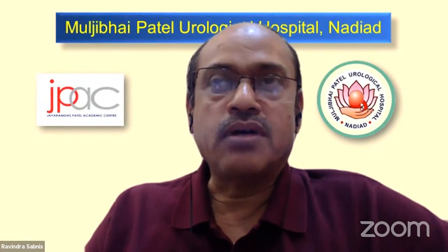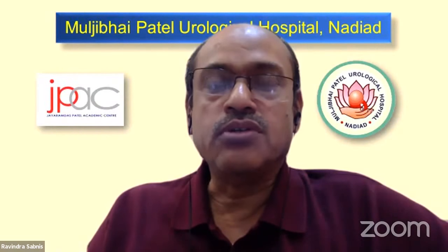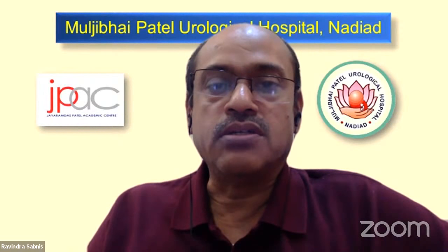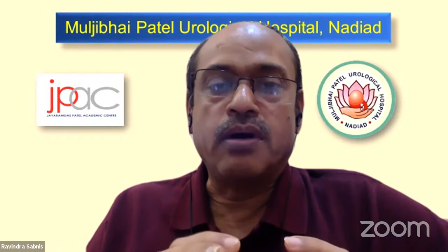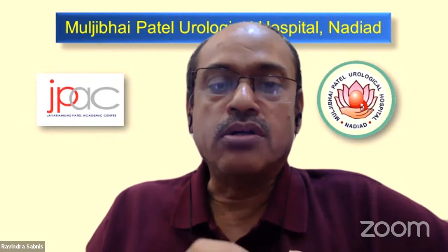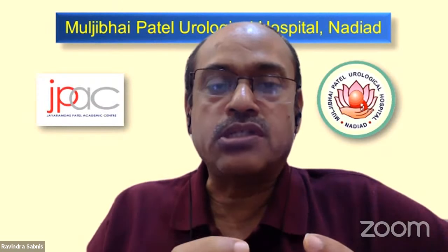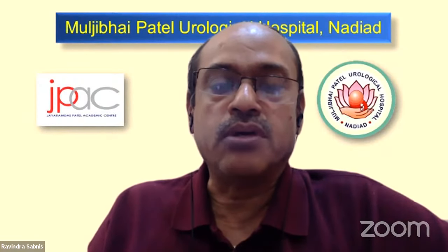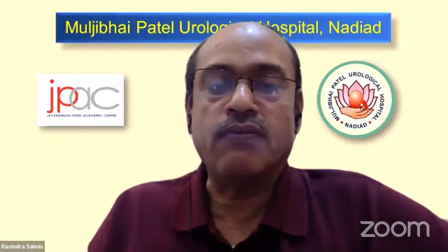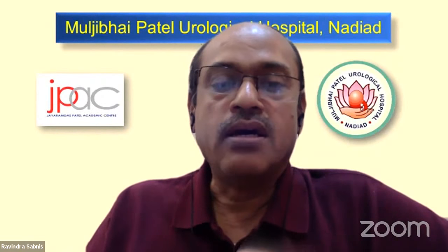And therefore, after comparing and studying these various stones with these breaking devices, what I feel is that the future is going to be on the suction. And there are two ways, as we discussed in this whole session: suction on the sheath or suction on the probe. If we are going to talk about the mini PCNL, then the suction on the probe probably may score over the suction on the sheath, because the way the trilogy or the shock pulse is fragmenting the stone, making the powder, and immediately, with powerful suction, sucking it out is far more beneficial. And trilogy or the shock pulse will score over the laser, because these energy sources are much, much more powerful than any amount of laser or any power laser if you take into consideration. So that's my frank opinion.